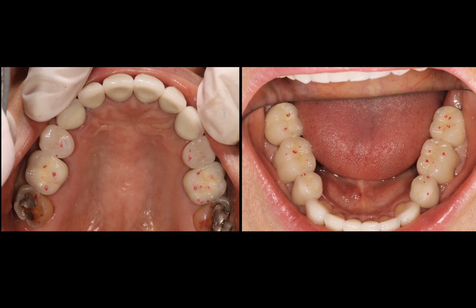But I want you to note the topography of the teeth. Look how nice they look. Okay, this is why we want to set up occlusion and how we can set it up without any stress, utilizing instruments, but more importantly, understanding why we're using those instruments.